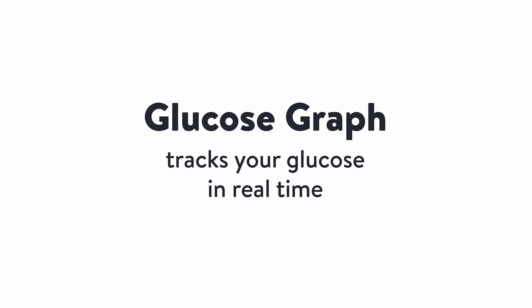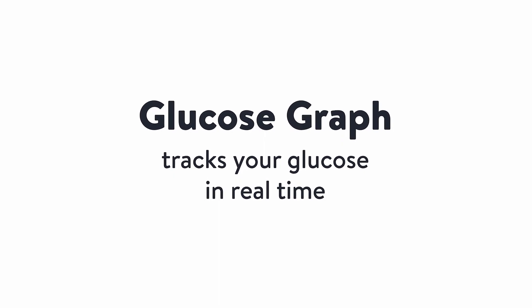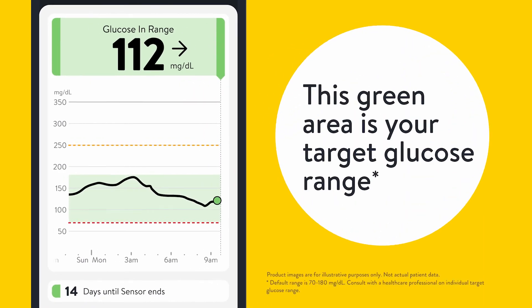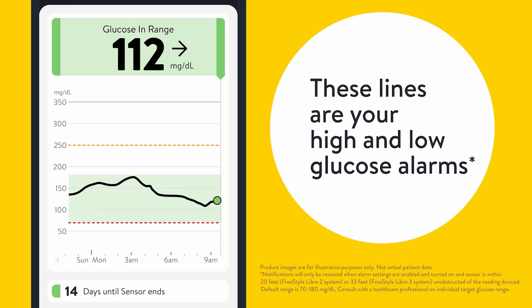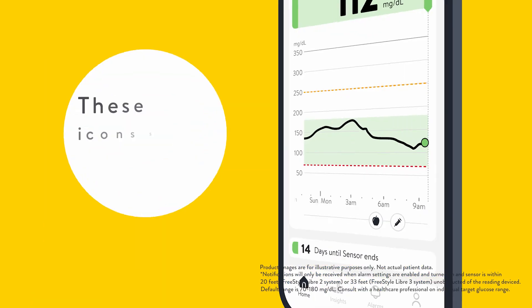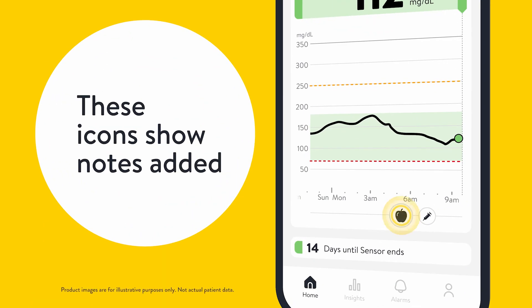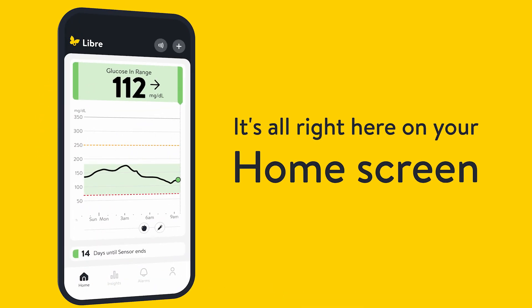Your glucose graph tracks your glucose in real time. This green area is your target glucose range. These lines are your high and low glucose alarms and can be customized. These icons show any notes you've added, and it's all right here on your home screen.